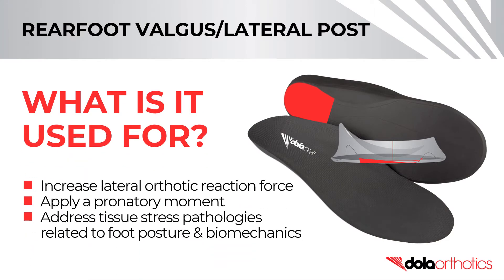A rear foot valgus grind is used to increase lateral orthotic reaction force, apply a pronatory moment, and address tissue stress pathologies related to foot posture and biomechanics.